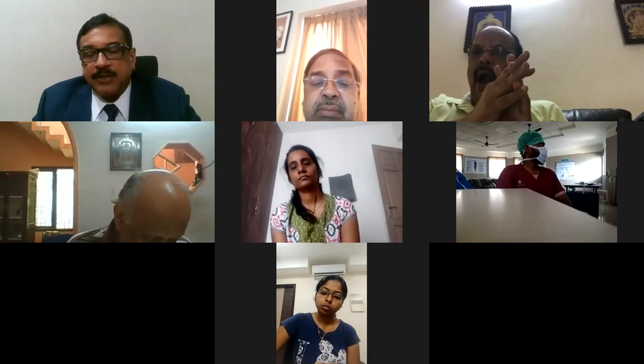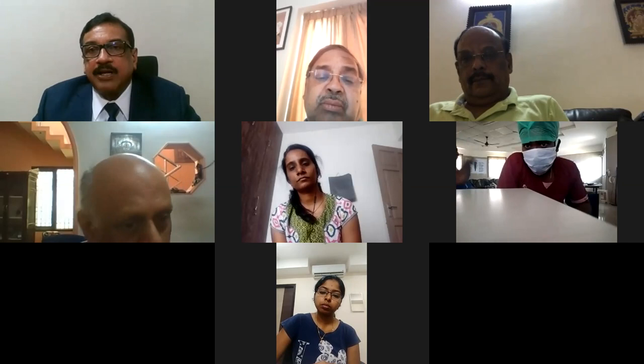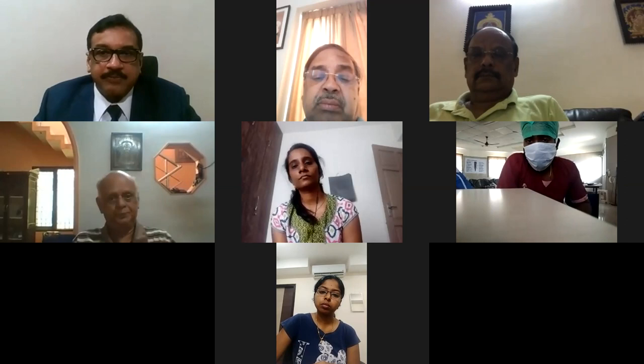So when you say MRI compatible, what you're trying to say is that you don't have to remove the implant. It doesn't mean that the implant will not throw a shadow over the surrounding. Am I clear, Rashmi? Yes, sir. Great.